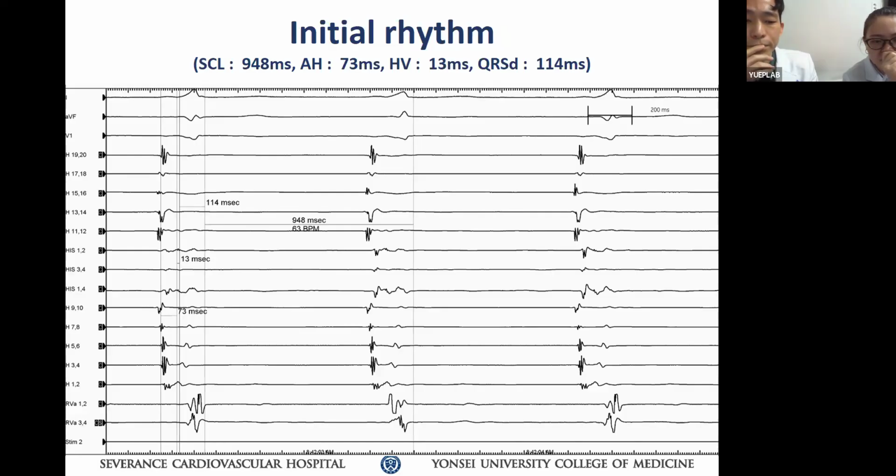Your CS catheter did not go in, but the CS catheter distal tip was pointing to the superior roof of the proximal coronary sinus region. Look at the EGM there. Very tight AV interval with some kind of notching in between. Do you see it? So I wonder if you saw this, and then the last ablation signal that you guys ablated, which one is better?